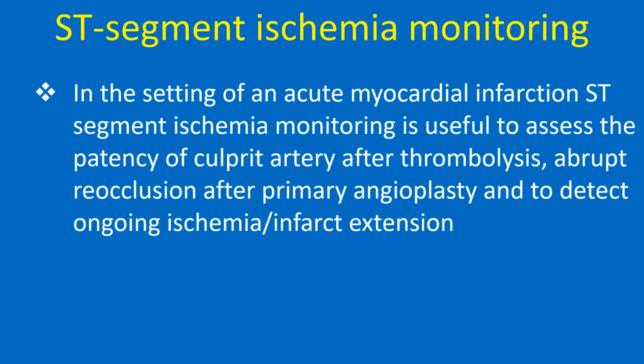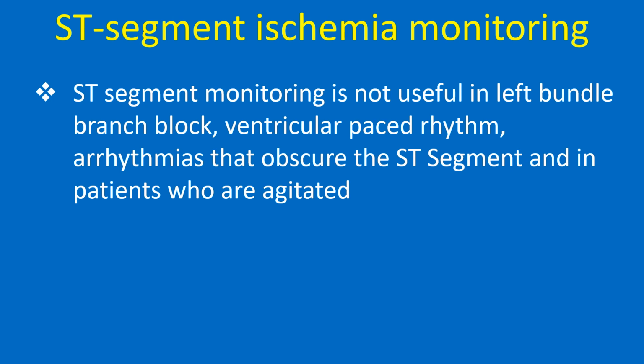In the setting of an acute myocardial infarction, ST-segment ischemia monitoring is useful to assess the patency of culprit artery after thrombolysis, abrupt reocclusion after primary angioplasty, and to detect ongoing ischemia or infarct extension. ST-segment monitoring is not useful in left bundle branch block, ventricular paced rhythm, arrhythmias that obscure the ST segment, and in patients who are agitated.